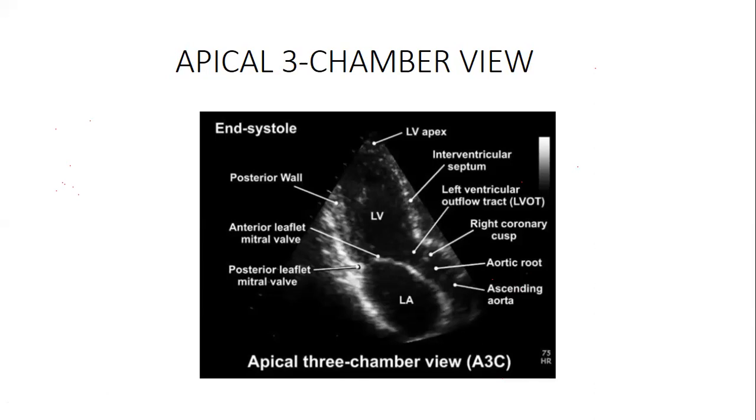For example, this is the left atrium, okay? Anterior mitral valve leaflet, posterior mitral valve leaflet. Blood will move from there, it goes this side, and then it will come and join the left ventricle outflow tract until it goes to the ascending aorta.